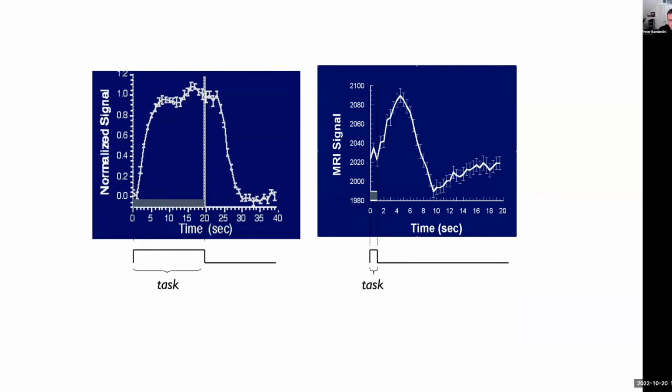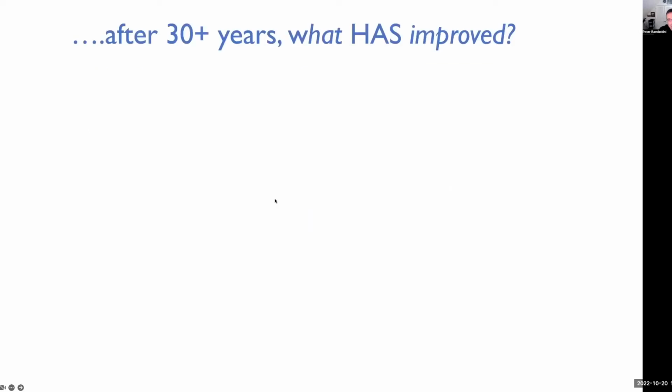I mean, there's physiologic noise. There's some interesting other networked activity. There's pulsations, but then there's this slow, sluggish response in the left and right motor cortex when you're tapping left versus right hand. So it's all there, and we're still working on that. And these are the hemodynamic responses that were induced either by a very brief stimulus or a long stimulus, and there's sometimes a post-undershoot. So just to quickly introduce the challenges.